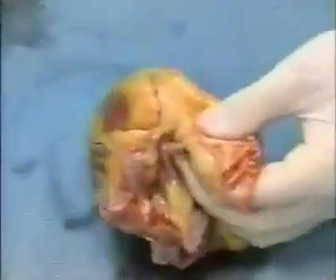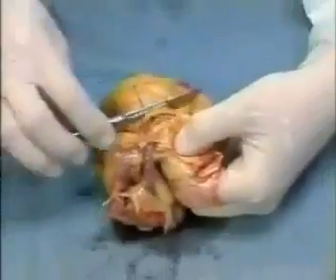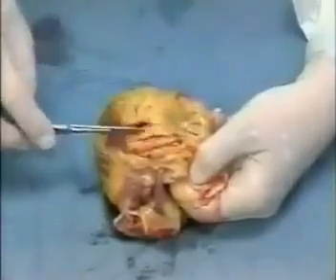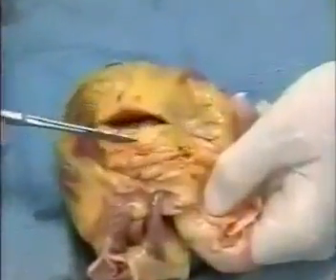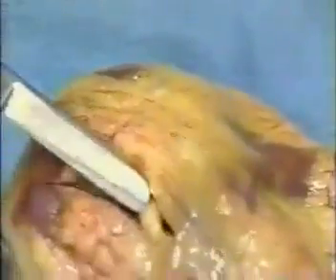Dr. Fricke's now examining the heart. The first thing she'll be doing is looking at the coronary arteries to make sure that they're intact and that there's no signs of thrombosis or atherosclerosis. The artery she's dissecting right now is called the left anterior descending artery, which is the vessel that supplies the anterior portion of the left side of the heart, or the main pumping chamber of the heart. Representative samples of the various tissues that are examined will be saved in formaldehyde, and so that's what you're seeing her do right now.